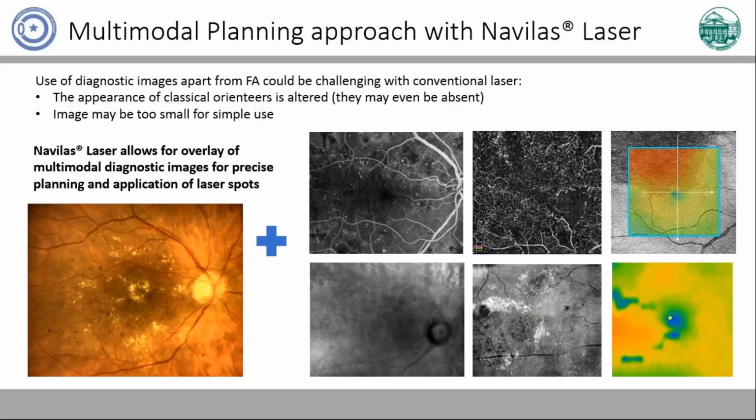Fortunately, today we have a navigated approach which gives us an opportunity to overlay just any image of multimodal visualization on the baseline fundus image and plan and perform laser treatment. And I believe that the combination of the navigated approach with en-face imaging is a very, very good and useful option.